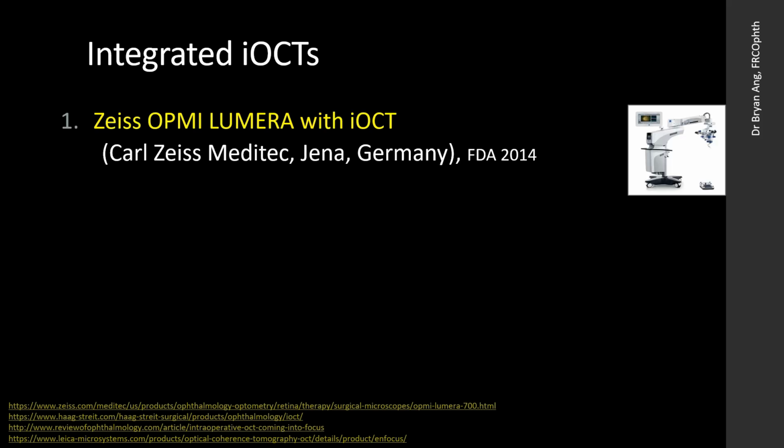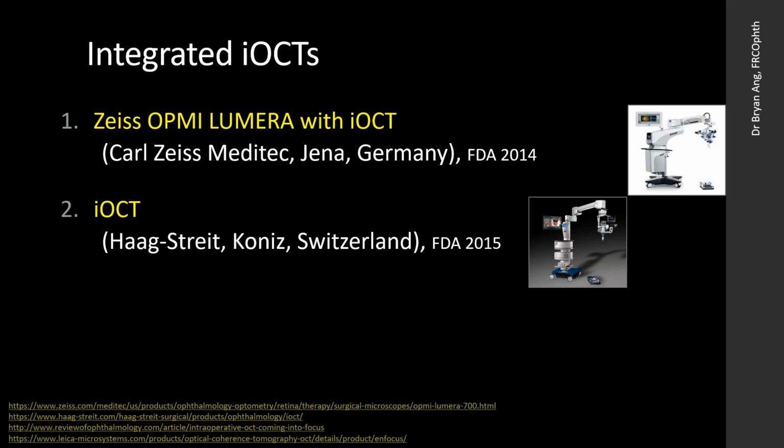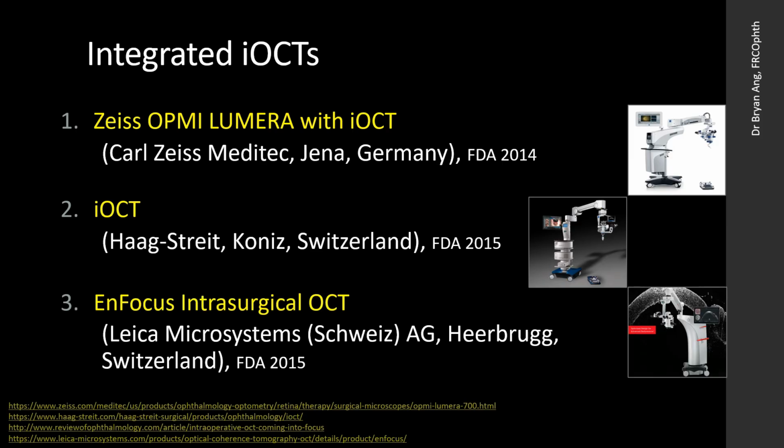Over the last decade, however, the iOCTs began to be incorporated into the surgical microscopes themselves. The three integrated iOCT platforms which have been FDA approved are the Opmi Lumera with the iOCT from Carl Zeiss, the iOCT from Haag-Streit, and the Enfocus Intrasurgical OCT from Leica Microsystems.